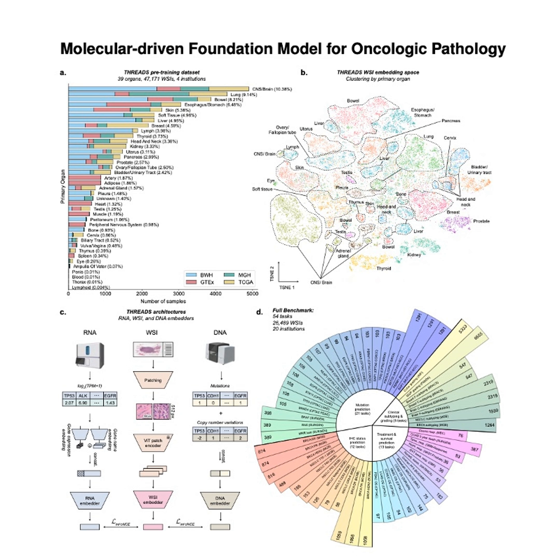Where did they manage to get all that data from, and was it diverse? The diversity was absolutely key. They pulled data from 4 major sources to ensure it wasn't skewed towards just 1 or 2 cancer types, which is a common issue. Okay, where from? So roughly half came from internal hospital sources, Mass General, MGH, and Brigham and Women's, BWH. That gave them high-quality clinical cohorts.